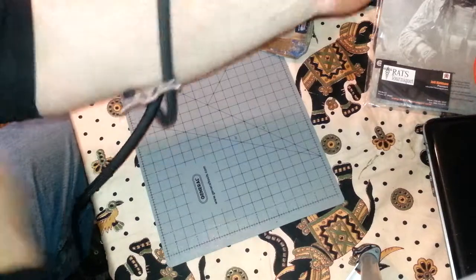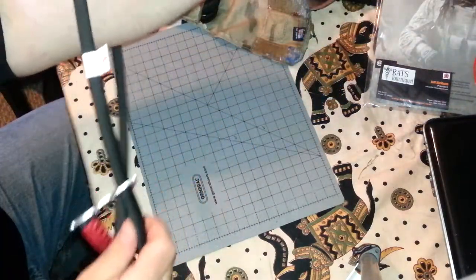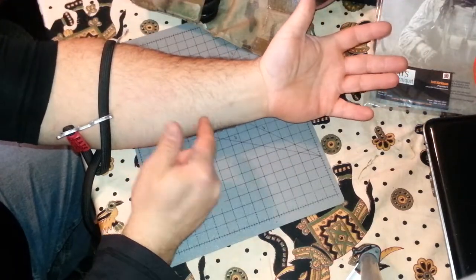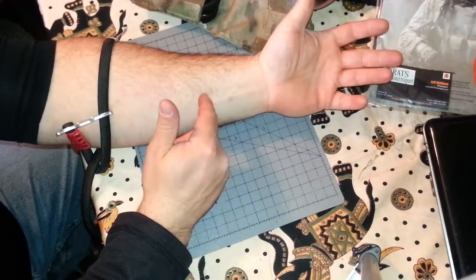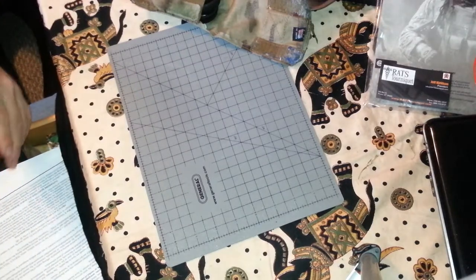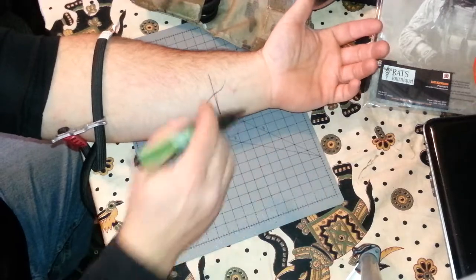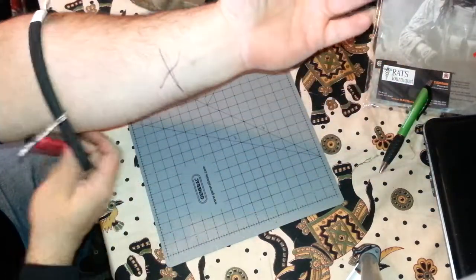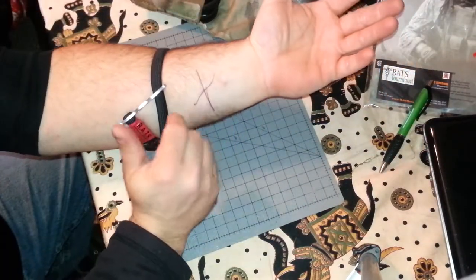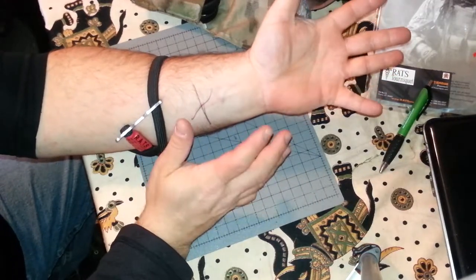Let's do it on skin. You pass it through that three-finger loop and you've created a slip knot. Let's say I'm cut here. Old school thinking — and a lot of people still believe this — you want to go two to four inches above your wound. With a cut it's pretty easy to identify the damage location, so two to four inches isn't a big deal.